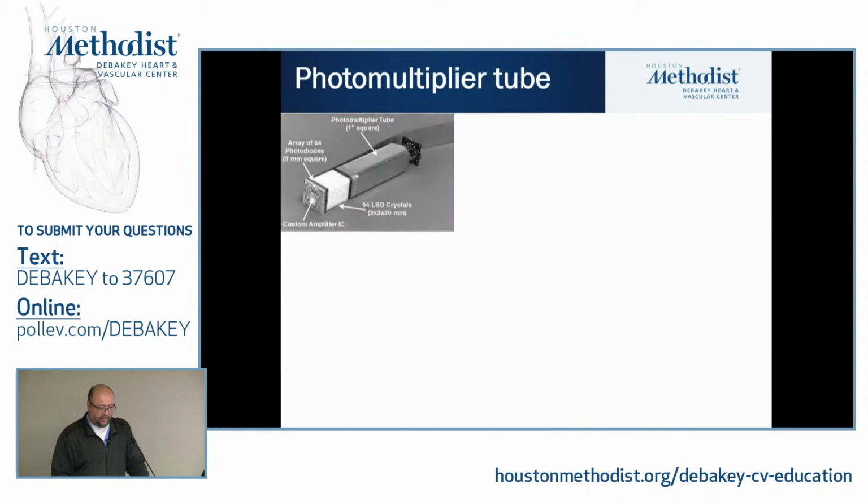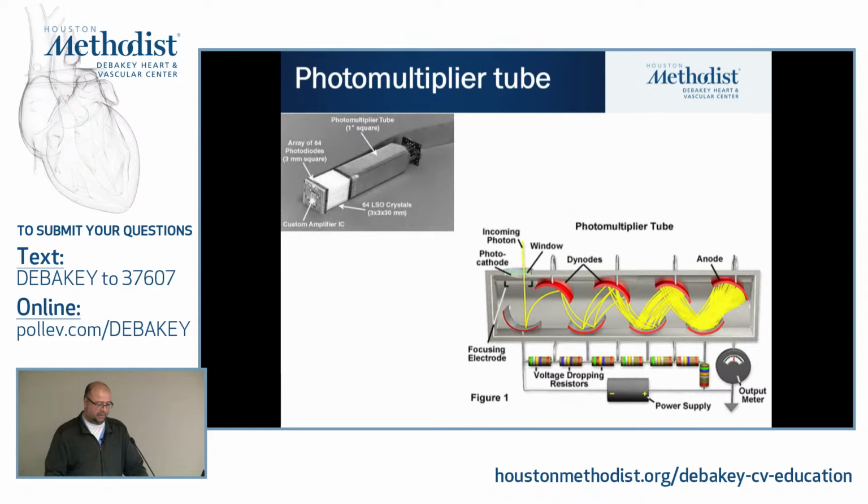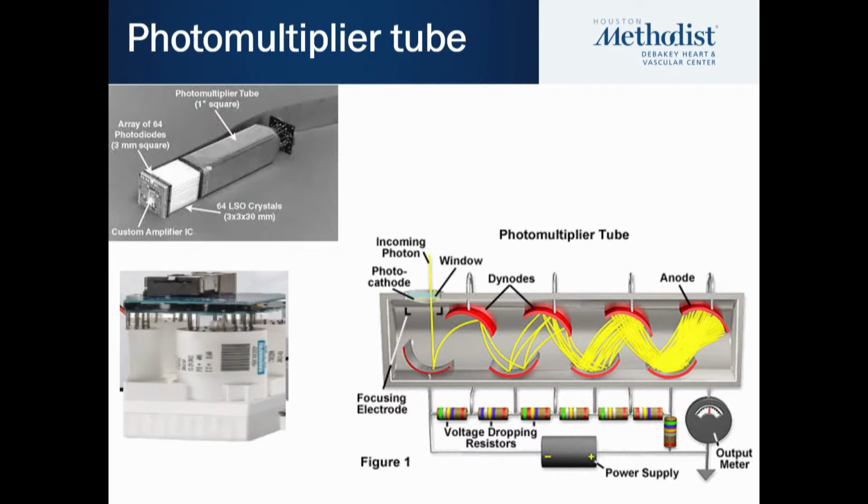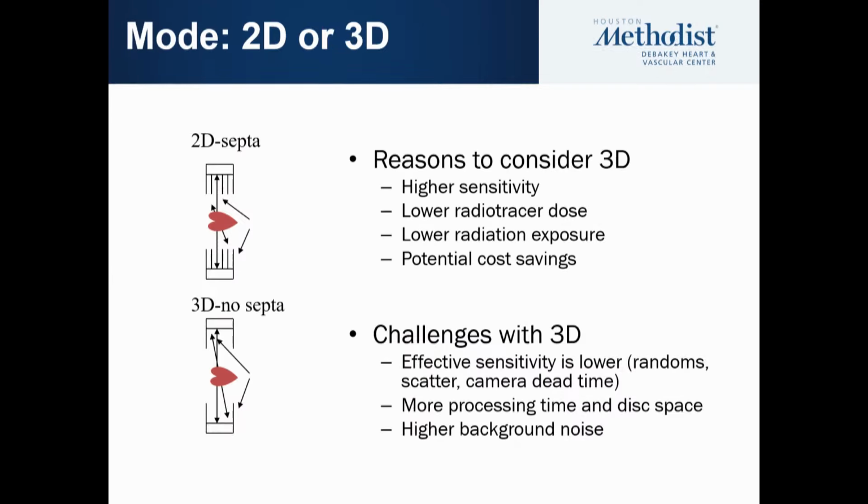After a photon comes in, it's going to go through the photomultiplier tube, because when the photon comes, it emits light, and this light has to be amplified. Similar to what you see here, it goes from one end to another to make the signal more intensified, and then we can capture it with the electronics and send it to where it's coming from. Nowadays, we live in an era that we have digital PMTs.